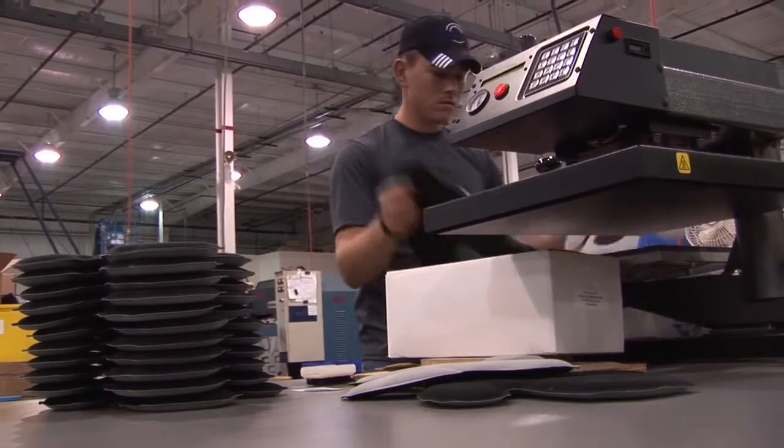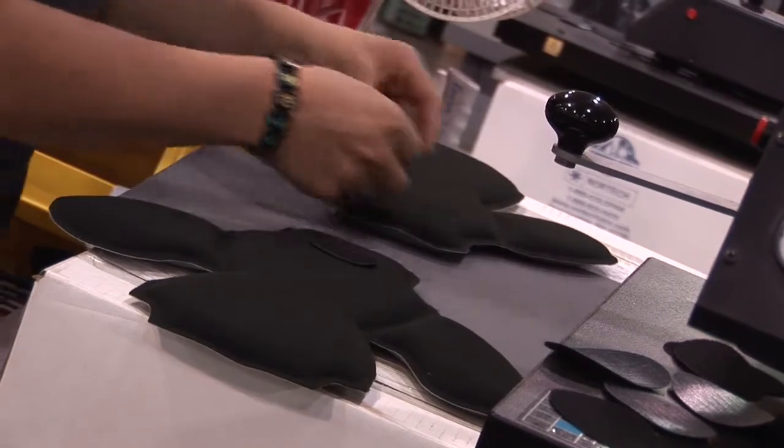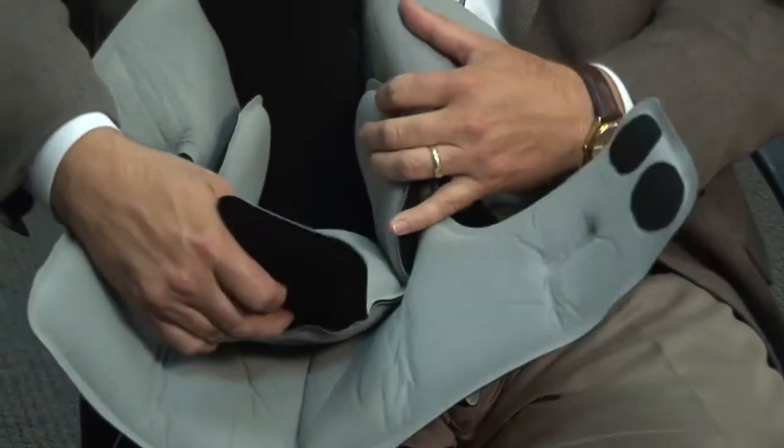Meaning, would it work for somebody in the acute care setting as well as the extended care setting and even possibly the home setting? And then the third thing I was really looking at was, did the product do what the company said that the product would do? It's an offloading device first and foremost. So when we open this product up, splinting is certainly there, but instead of using a splint to actually do the offloading, we use a gel air pad within the confines of this piece. So this piece here is really the magic to it. It's what offloads that heel.